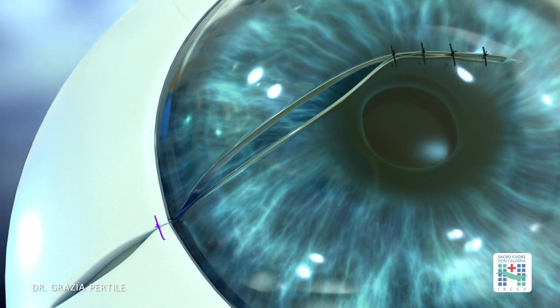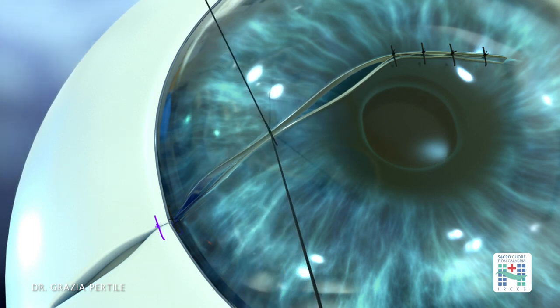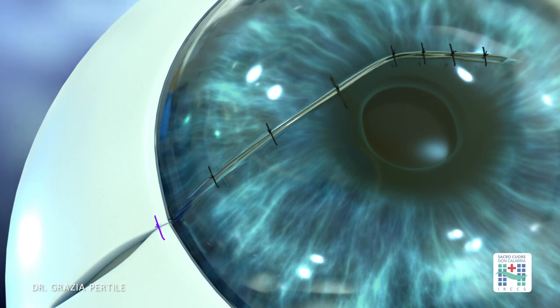It's crucial to achieve a watertight suture of the anterior segment while performing the necessary manipulations to inspect the extent of the scleral wound. The process involves placing a suture at the midpoint of the remaining wound extension, and then again at the new midpoint, ensuring an even distribution of the tissue. Injecting viscoelastic substance into the anterior chamber through a paracentesis during the suturing procedure can help restore volume and facilitate the process.